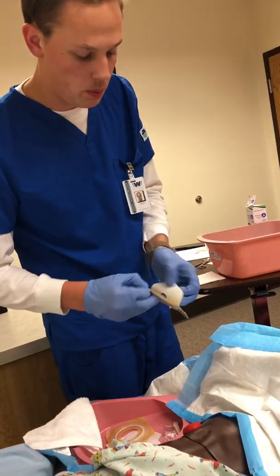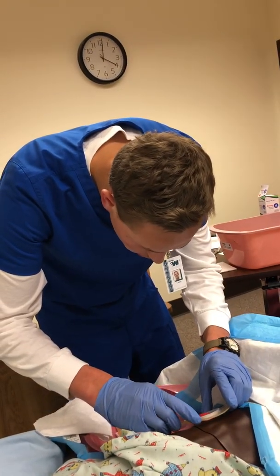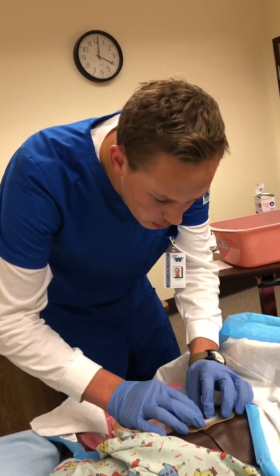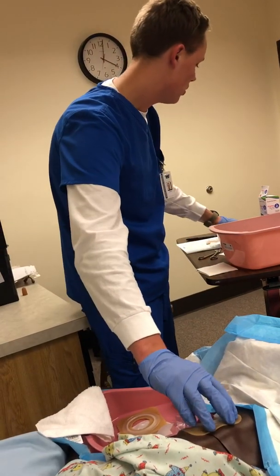So I would just simply peel this off and center it over the stoma and put it on, working from inside to out, not pressing too hard, just making sure it'll hold.